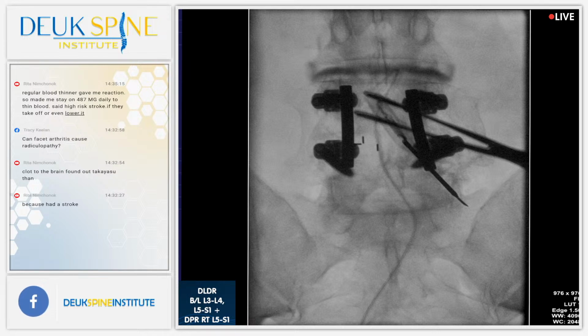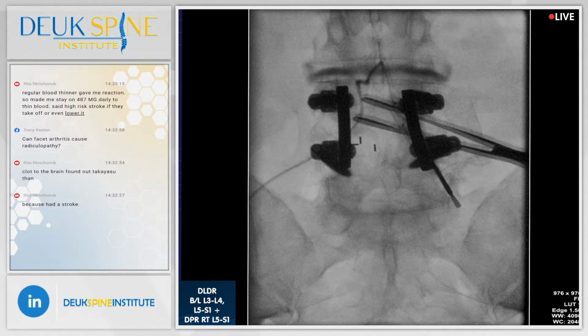And I will say this. Many people have different anatomy to their spine, but a few things hold true no matter who they are or where they come from. One of them is that this pain nerve runs right where the tip of my probe is, right there, in every human being on Earth.